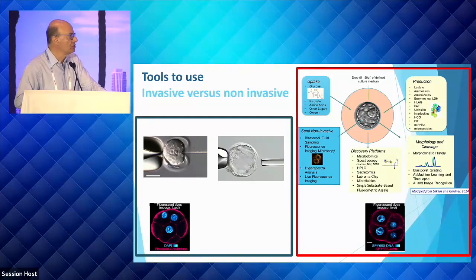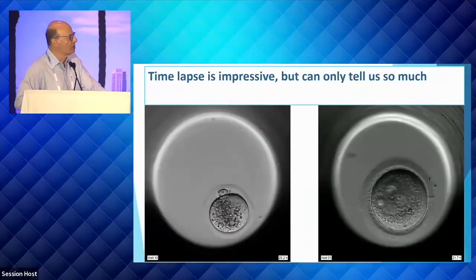One of the techniques we use is also fluorescent dyes, and on the left there are fluorescent dyes that you can use and analyse embryos when you fix them, but actually I'll talk also about some new technologies using what are called spy fluorochromes that we can actually image embryos live, and we can actually add these fluorescent dyes, and they're not harmful to the embryo. And these are techniques we used many, many years ago, but these are actually more up-to-date fluorochromes. So there are many ways we can learn about human embryos.